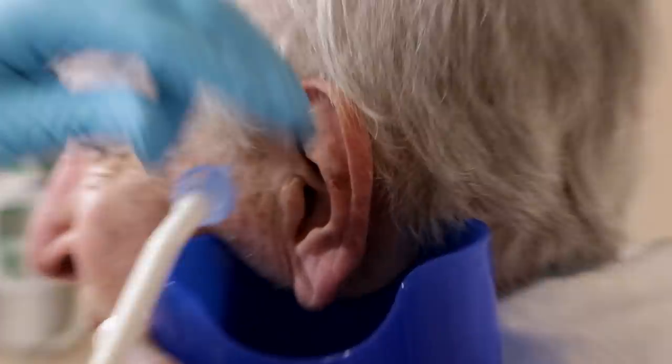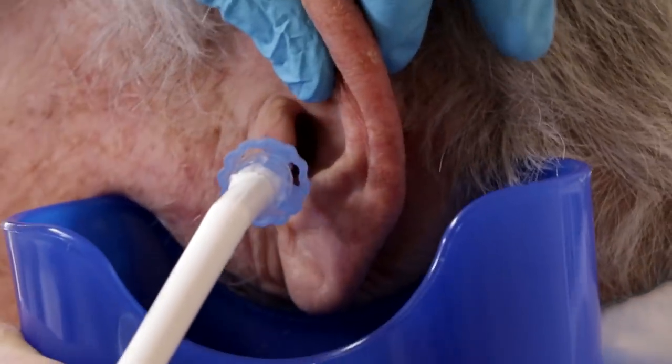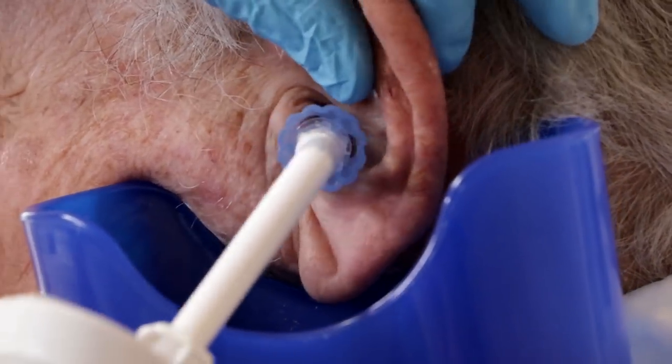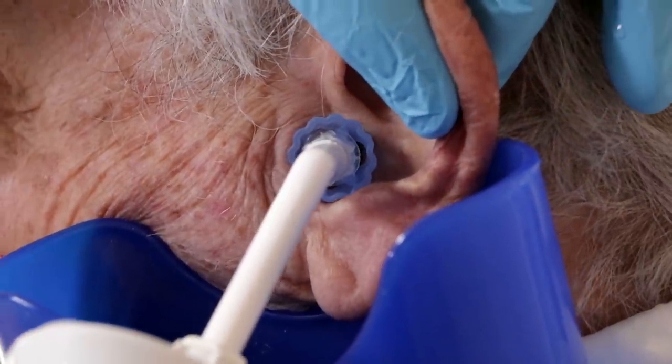I'll come in from this side. We're probably at about eight right now — okay, here we go.